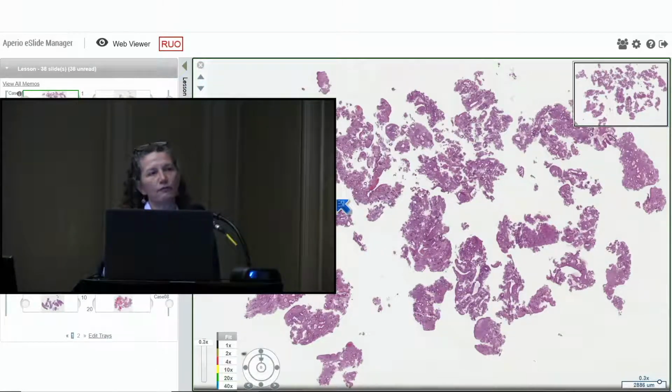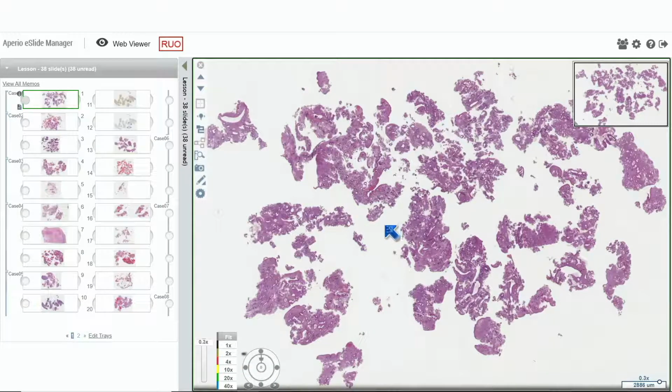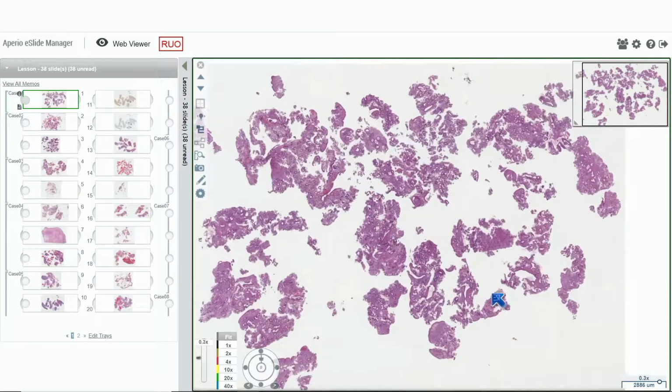And that's very different from a precancerous change, which is a clonal neoplasm. And in general, those start locally within the endometrium. They can overtake the entire compartment for sure, but they have a very different look to the background endometrium, and that's how you can recognize it. And many times it has associated altered differentiation states like mucinous or squamous and morular change, and we're going to talk a little bit more about morules as well. But this first case really was to introduce the concept of benign changes secondary to hormonal effect.